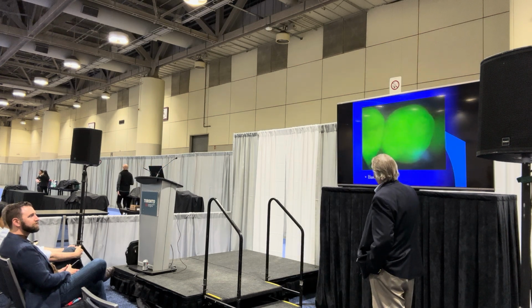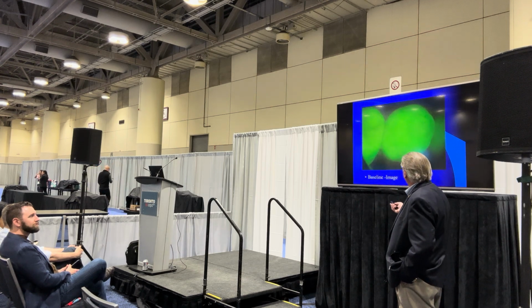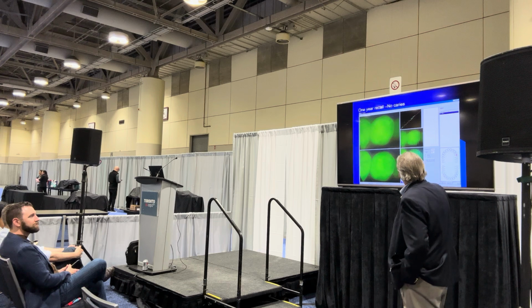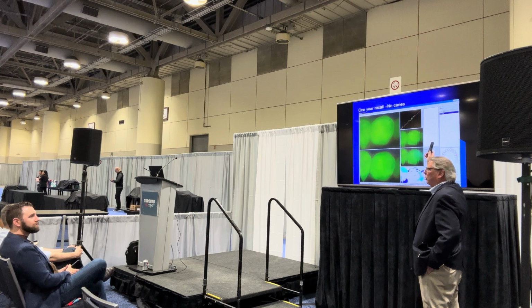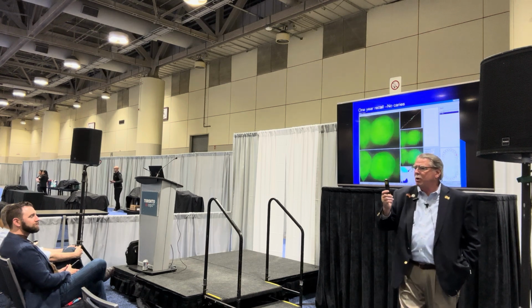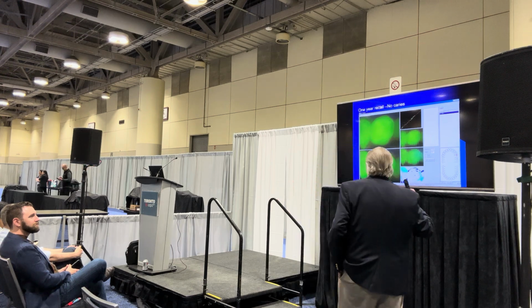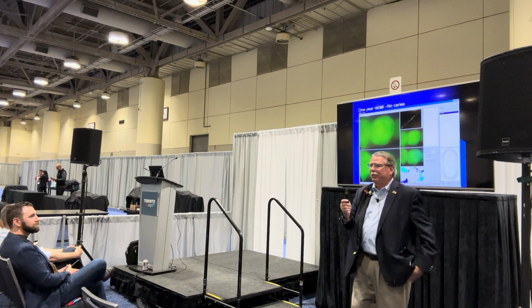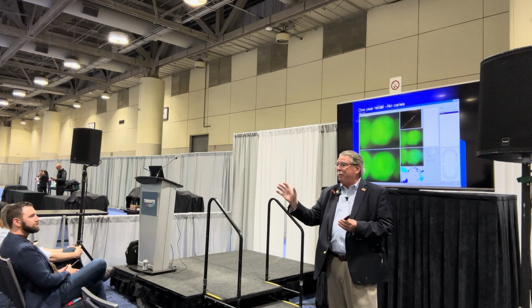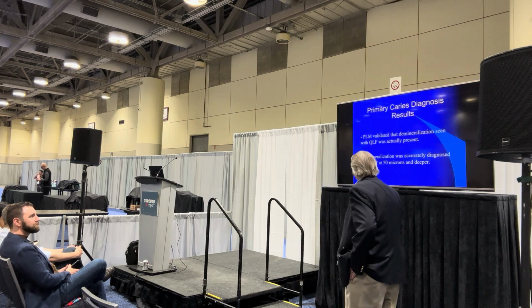So this is kind of just an image. This is a baseline image with the QLF inspector machine we used. But what I want you to notice right here, it runs a regression analysis on exactly what position you're in. So when you come back, you can set it so you have to be within 3% of what it originally was, so you're not creating any shadows to make it look differently. And it was kind of cool.